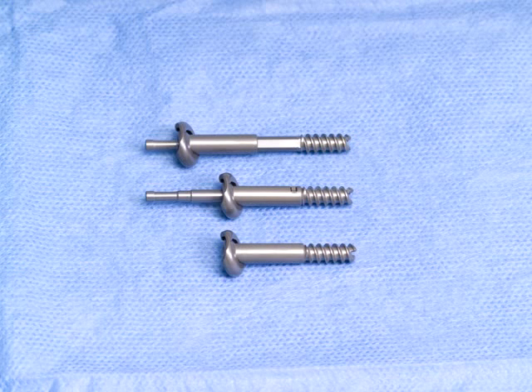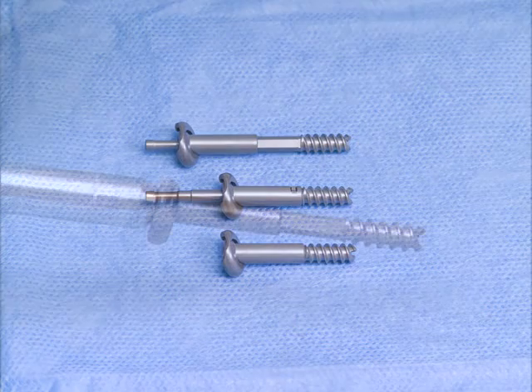The bone lock implants used with the PERPOS system are 4.5 millimeters in diameter and are as long as 40 millimeters or as short as 30 millimeters. The axial compression of the one-size-fits-all device allows the bone lock to size to the appropriate length in vivo.